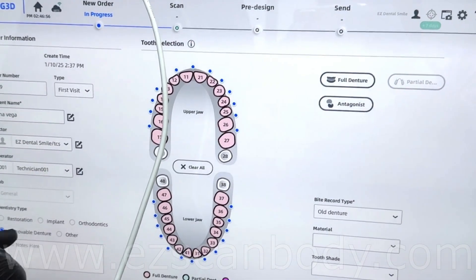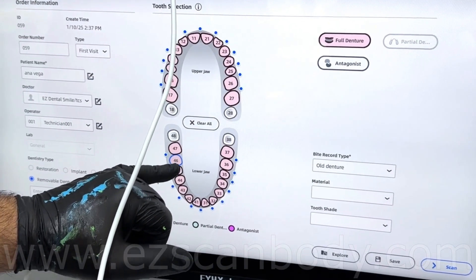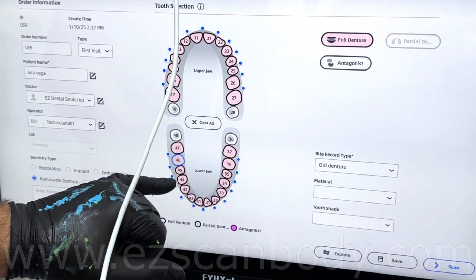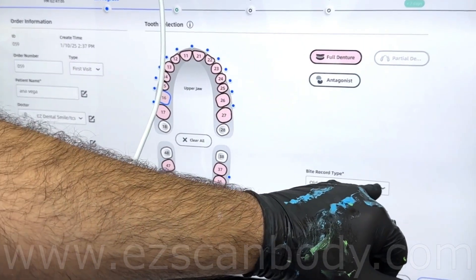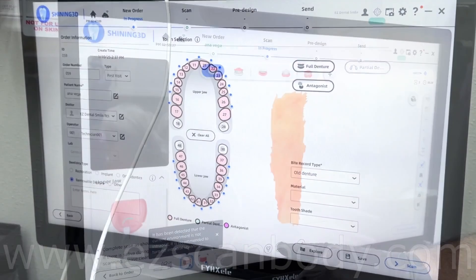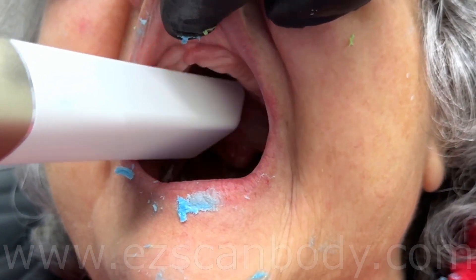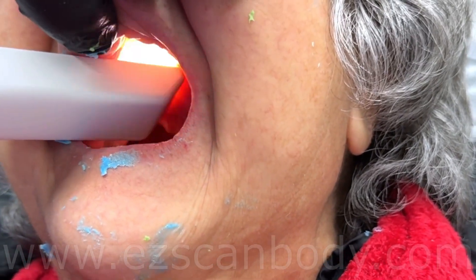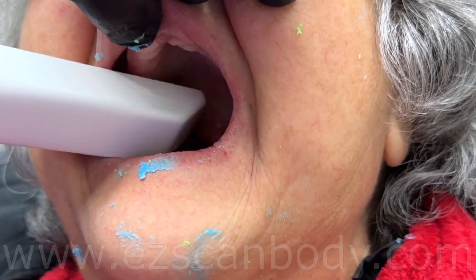With a Shinning 3D intraoral scanner, click the removable denture at the bottom left and the full denture top right. For bite record, choose old denture. I have tried a few intraoral scanners and found out the new Shinning 3D Elite is scanning dentures easier and faster than others. It also has a photogrammetry scanning option, which makes it good for all-on-X cases.